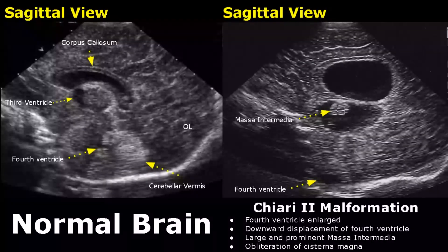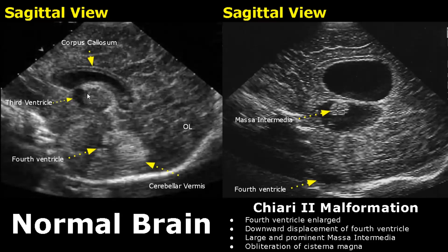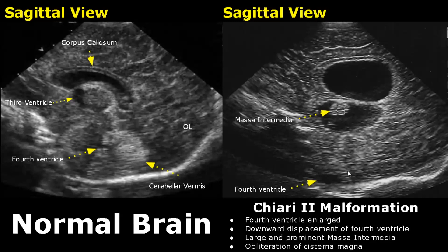Chiari 2 malformation has a number of features. There is downward displacement of the fourth ventricle and it is enlarged as well. The massa intermedia is a linking tissue between the thalamus and third ventricle — normally it won't be visualized, but in Chiari 2 malformation it can become enlarged and prominent. The third ventricle is also dilated. The cisterna magna is the space between the vermis and the posterior rim of the foramen magnum; in Chiari 2 malformation this space is closed — this is called obliteration of the cisterna magna.